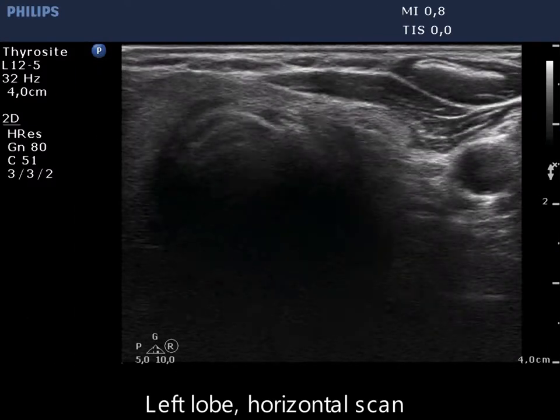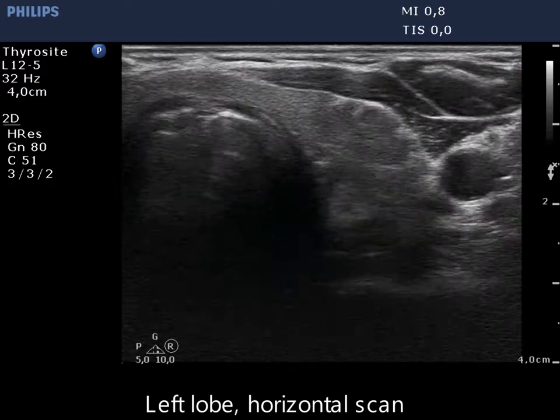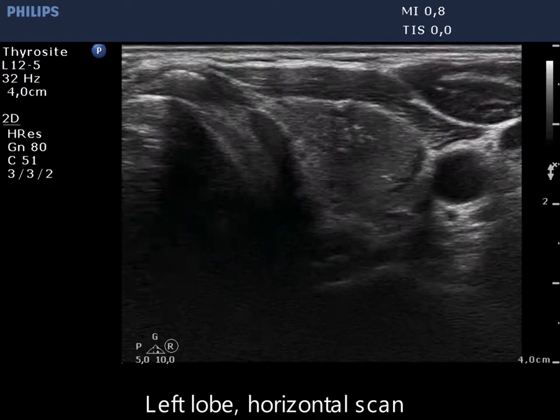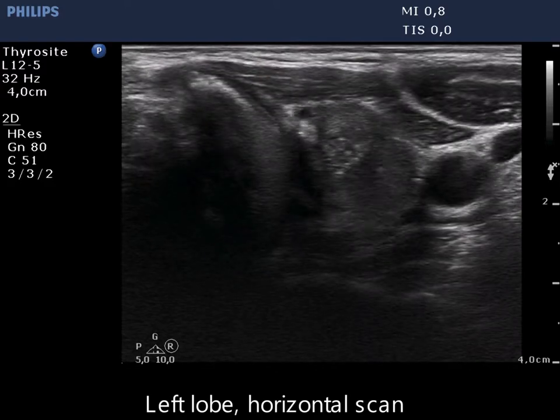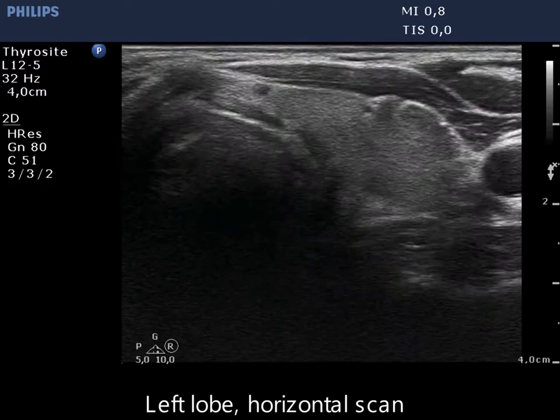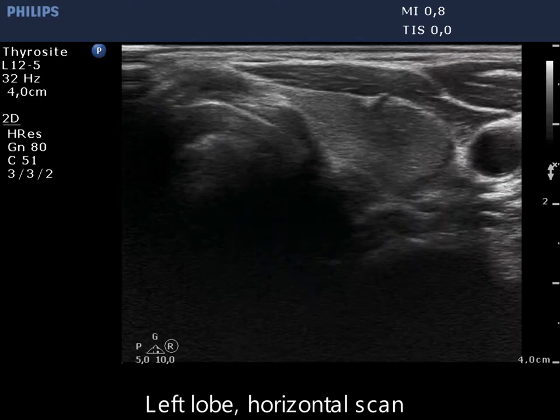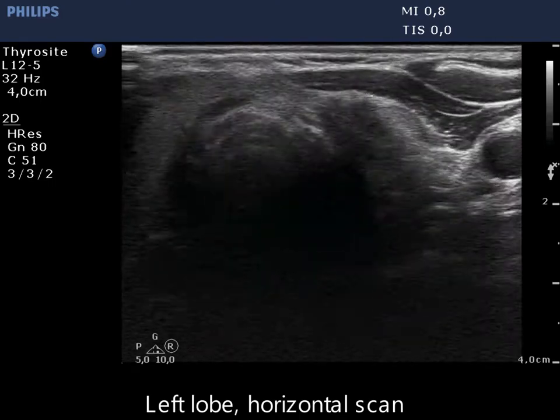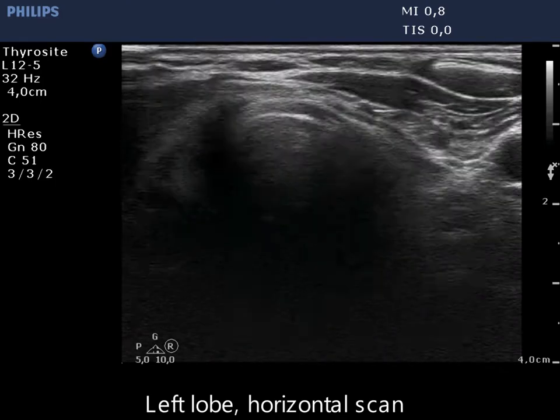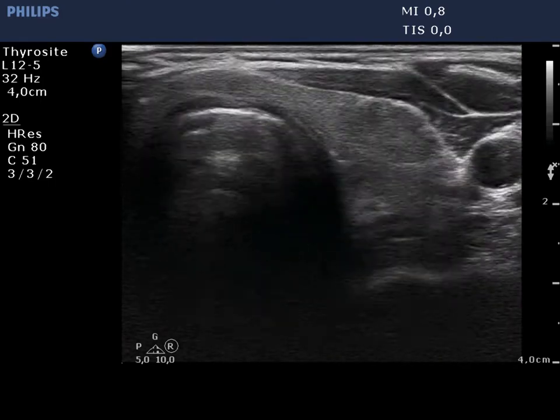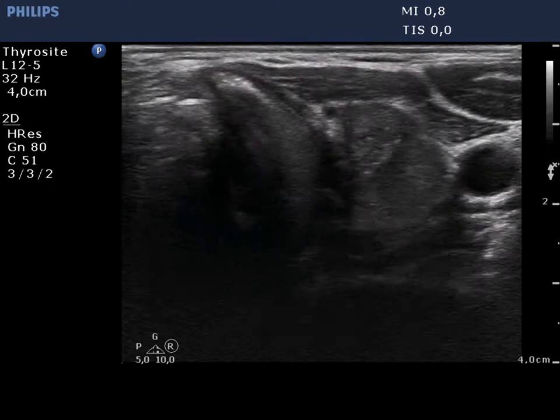The left lobe has two hypoechoic lesions, one in the upper and another one in the lower pole. The upper nodule presents microcalcifications. The upper lesion has blurred borders.